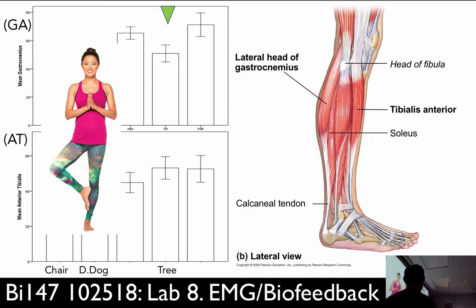Then tree pose. So in tree pose, we have pretty high levels of engagement for both muscles, actually, don't we? Why is that? What do you think? What's going on here? Let's look at the pose. Dissect that for me.